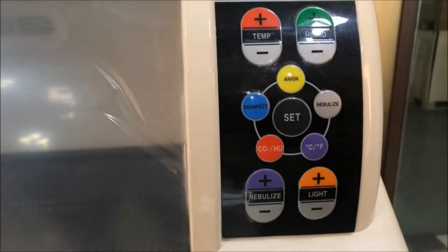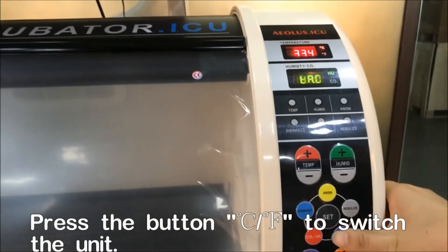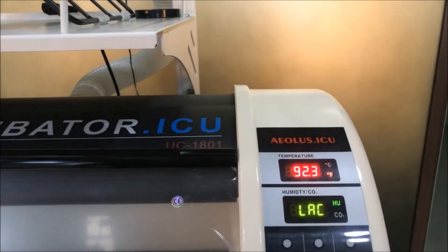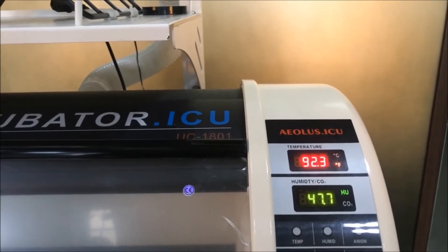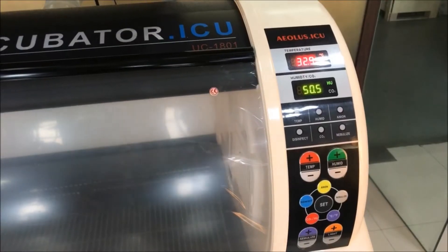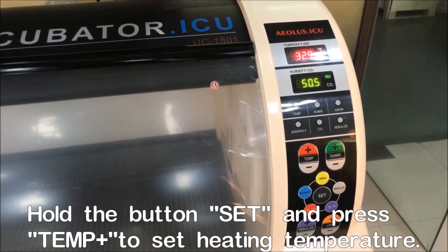When you press the button, you are going to shift between Fahrenheit and Celsius degrees. When we want to set the temperature, we need to hold the Set button and press the temperature plus button to enter the setting mode.